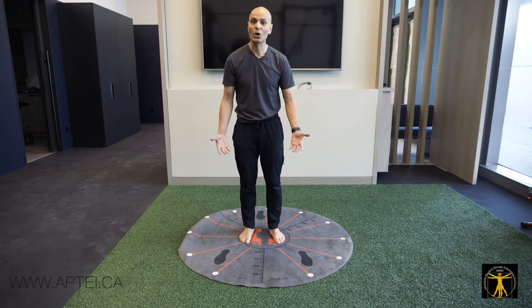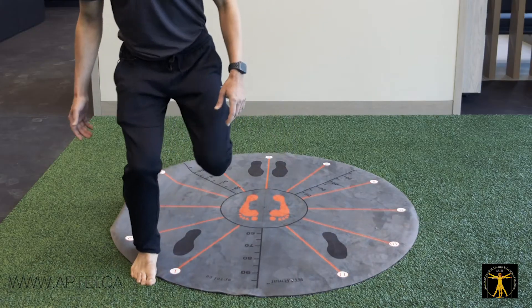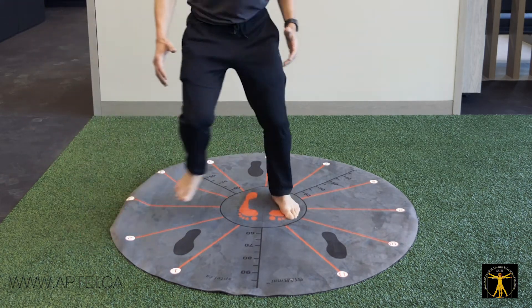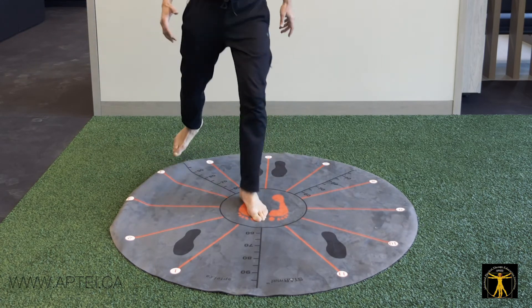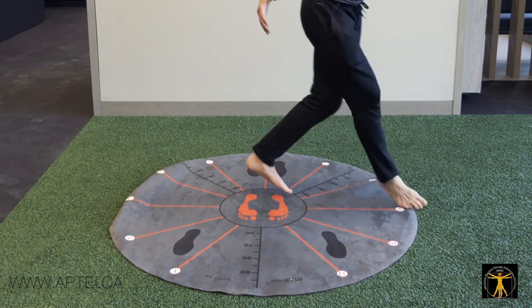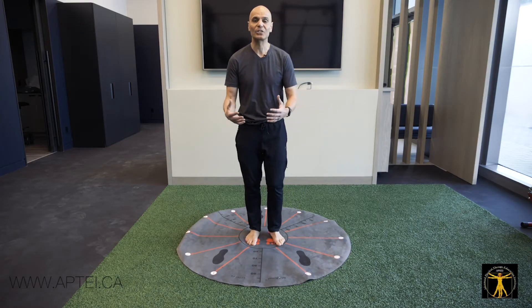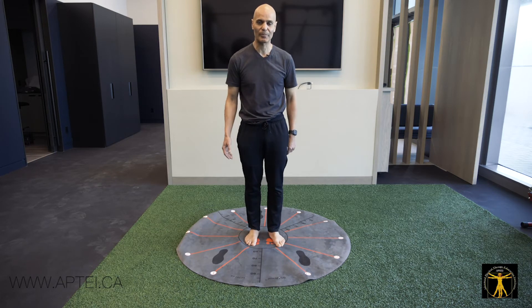Then we can do lunge hops. Lunge hops means you start from the center, lunge to 1 o'clock, hop there, and hop back. Whether you're playing soccer or tennis, this simulates those movements, especially when you get to the crisscross positions. The best way to prevent injuries is to simulate the sport as closely as possible.